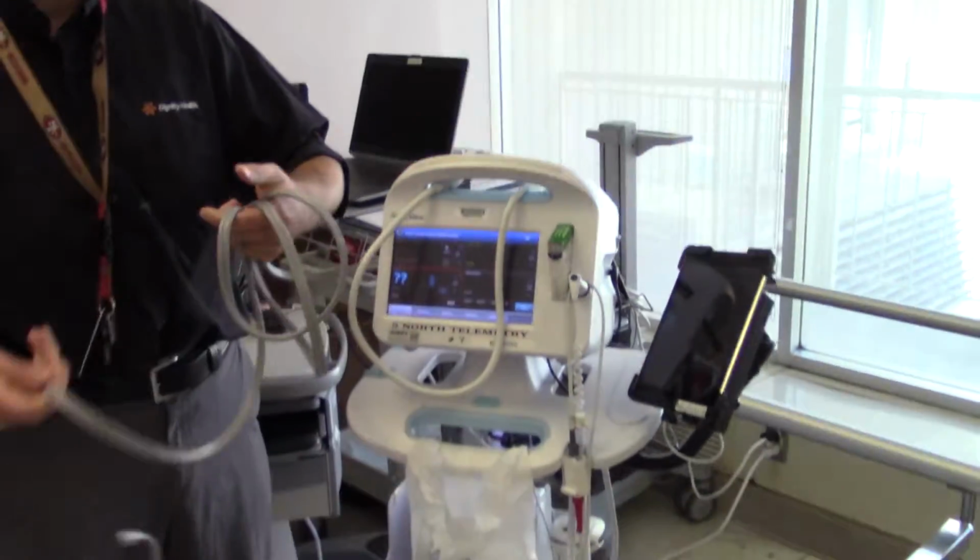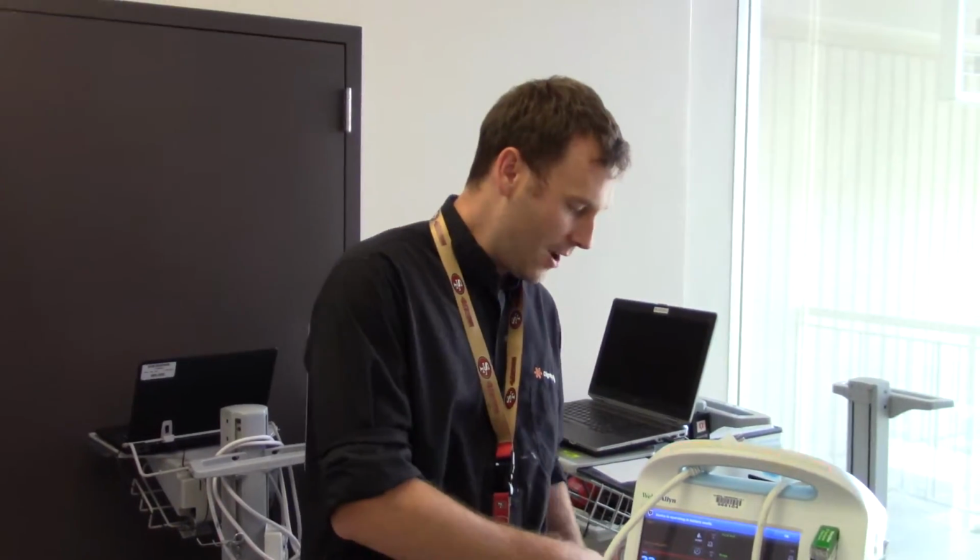That's me. He's our main man in helping put together these ADEPT stations. Do you do all the assembly, Dustin? No, Biomedical typically does the assembly on the actual device, so we just provide the parts. So you order all the parts? Correct, ordering, and then we provide guidance to Biomed that they do the actual bolting on of devices onto the medical device. I see, okay.